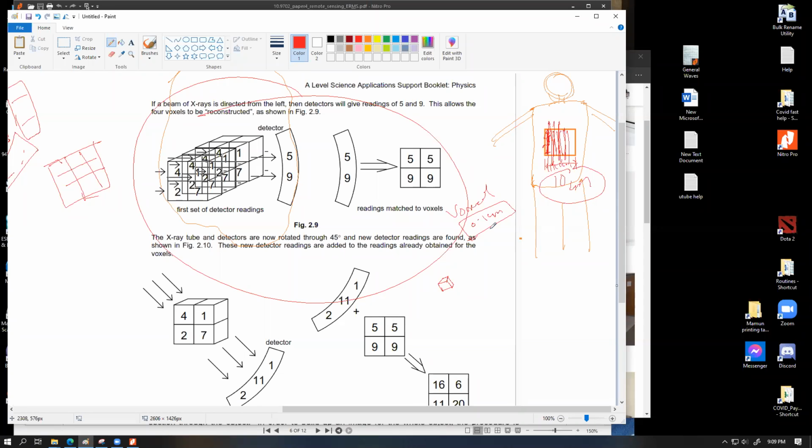There is no fixed number for how many slices you should do for a certain voxel scan. Usually the doctors go for, I'm not sure, but I believe this is a variable. You can set this voxel value in your machine whenever you're going for a scan, because different parts of the body might require different types of scan.